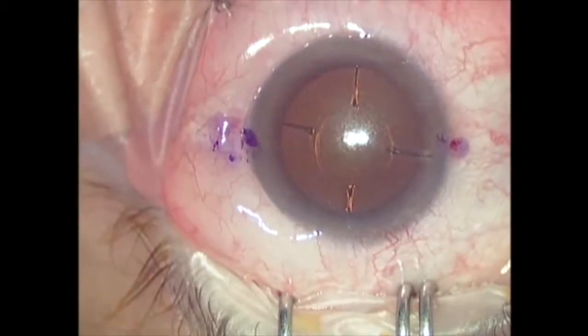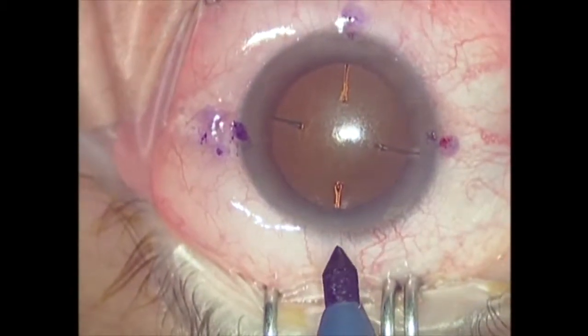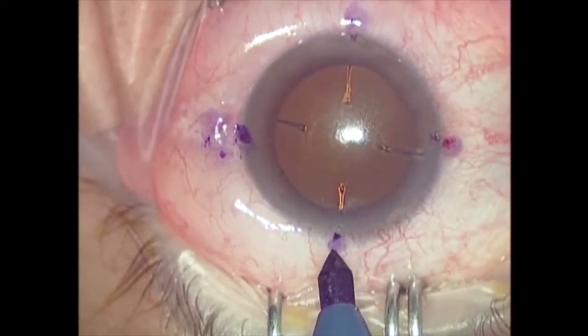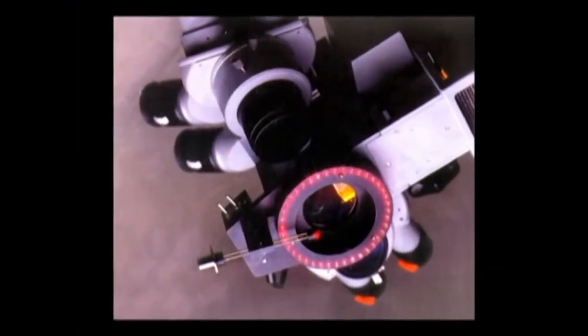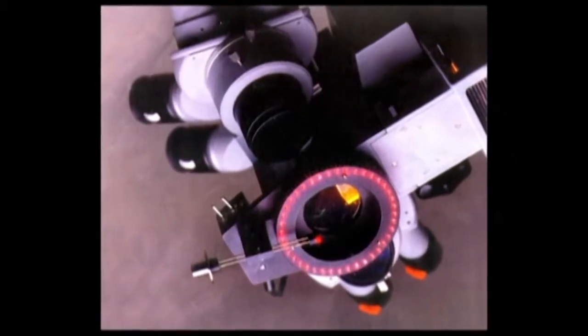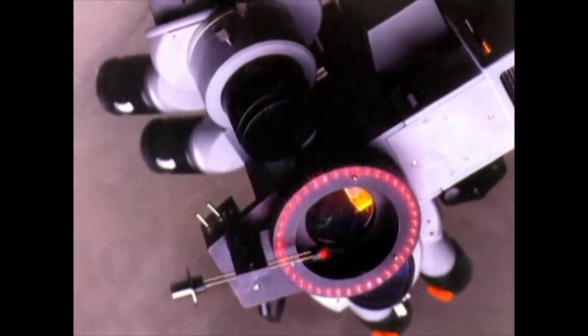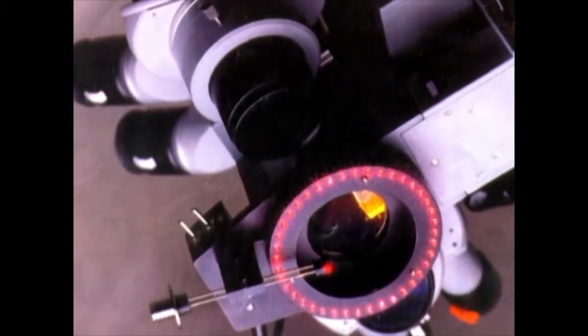To Dr. Gills, one of the most challenging aspects of surgically treating keratoconus patients is identifying the correct axis for IOL alignment as well as incision placement. He relies on the surgical keratometer to identify the steepest meridian within the central 3 mm optical zone, which impacts the patient's functional vision. He claims that treating astigmatism in patients with keratoconus is perhaps more art than science.